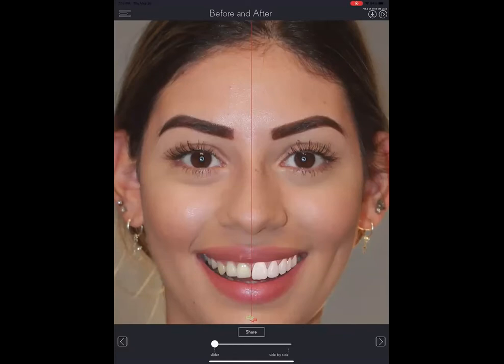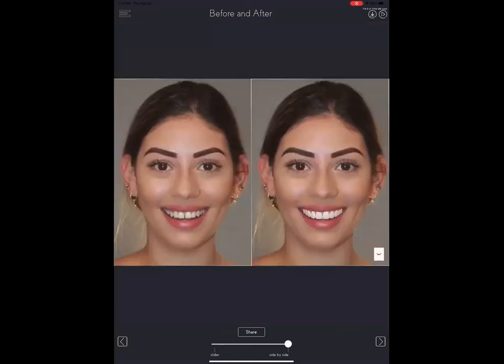It can open the patient's mindset to a more complete type of treatment plan, to treatment plans that the patient maybe didn't even notice, didn't even see. So this is the power of doing smile simulations powered by artificial intelligence. This webinar, as it has become very popular, is for you who want to change the way you do treatment plans in your practice.